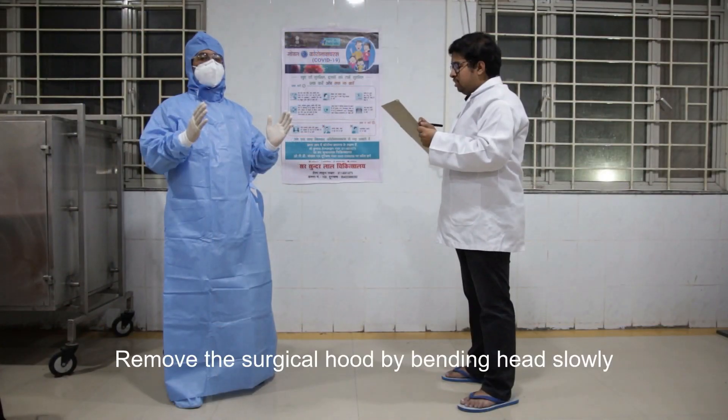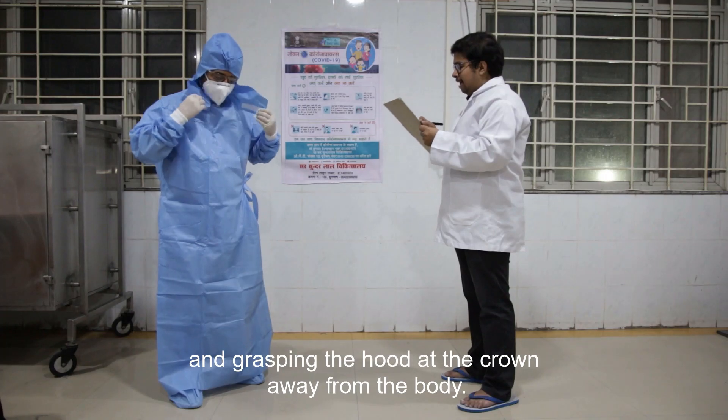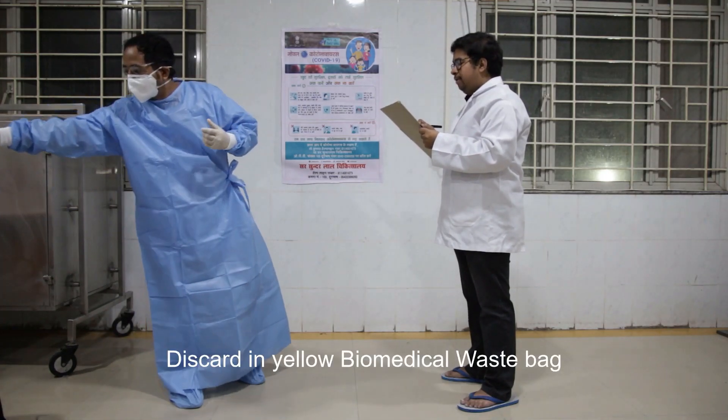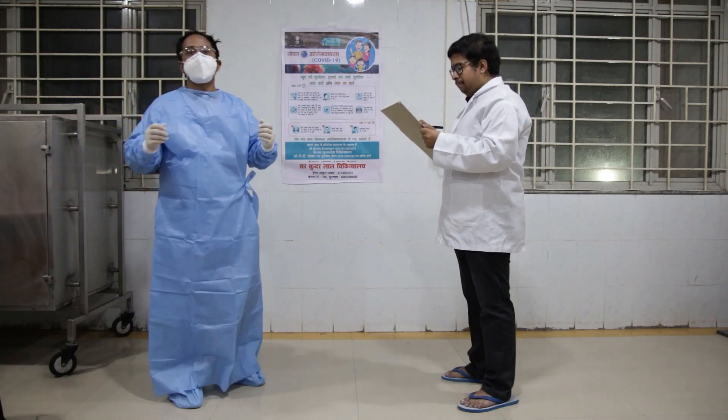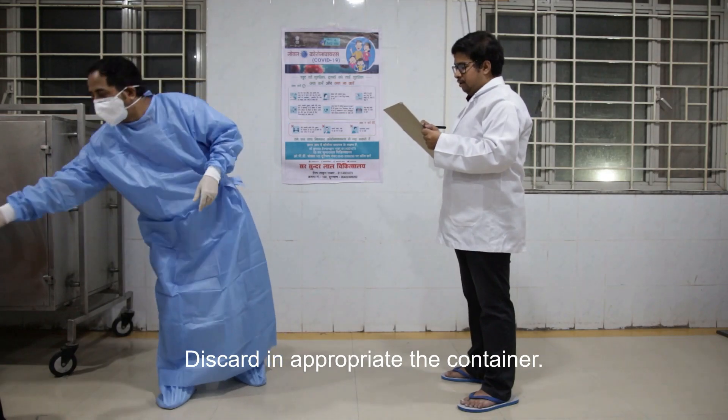Remove the surgical hood by bending the head slowly and grasping the hood at the crown, pulling it away from the body. Discard in the yellow biomedical waste bin. Remove the eye goggles and discard in the appropriate container.